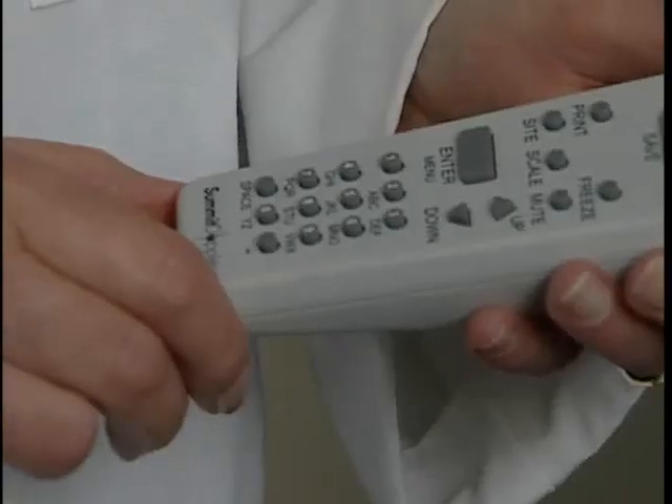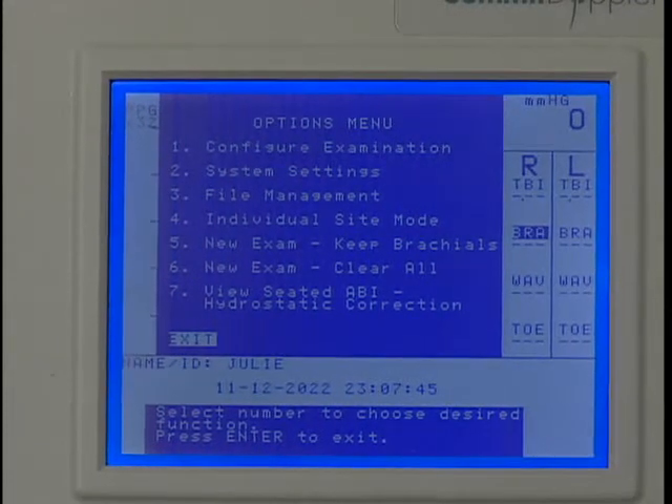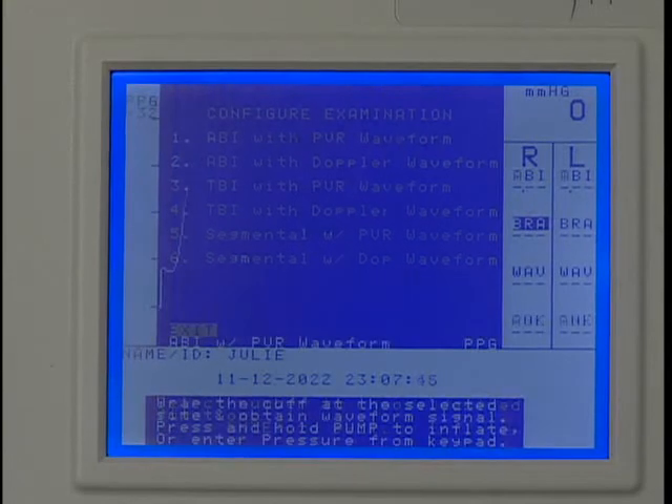Press ENTER MENU to open the options menu again and press 1 to configure the exam. Press 1 to select ABI with PVR waveform.